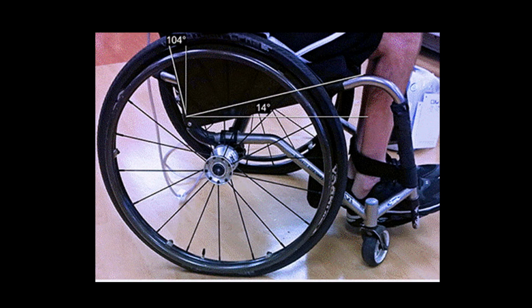But just imagine doing that. But this was his chair. So it's 14 degrees of seat slope, which is the same as my chair, except, and this template was replicated year in, year out with no questioning or anything. And he liked a low back.